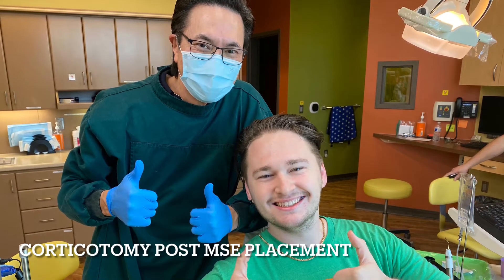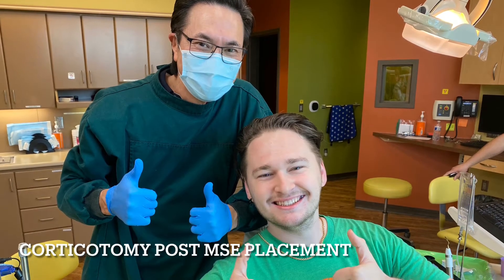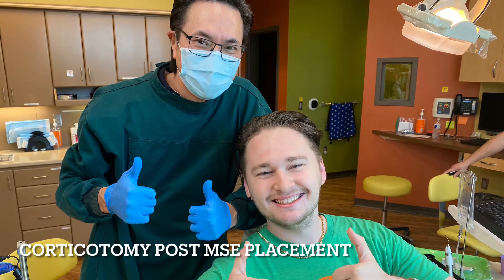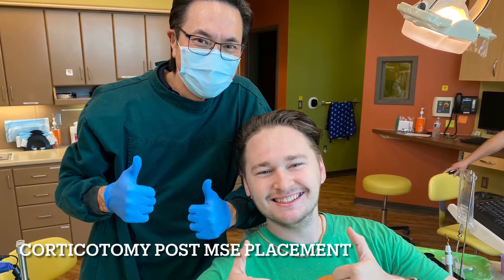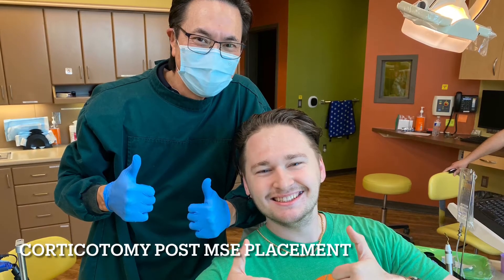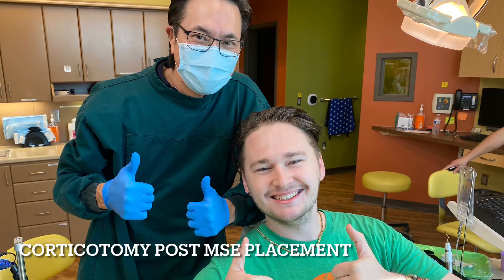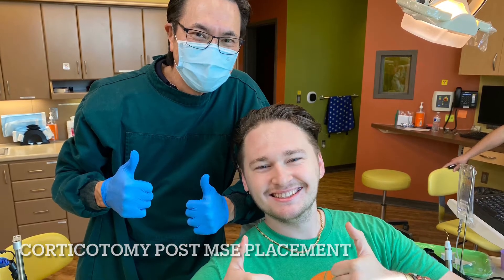In this short video, you will watch the process of the corticotomy procedure after a patient already has an MSE placed.